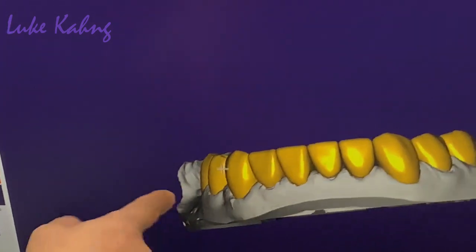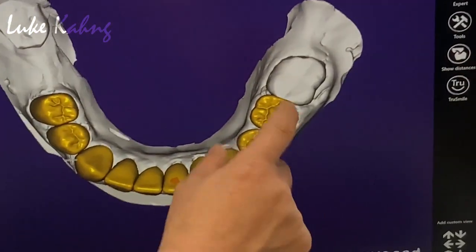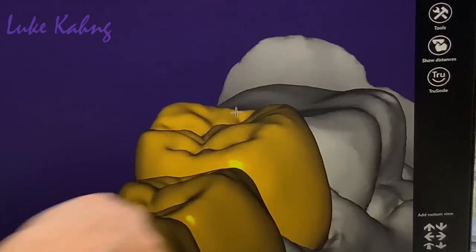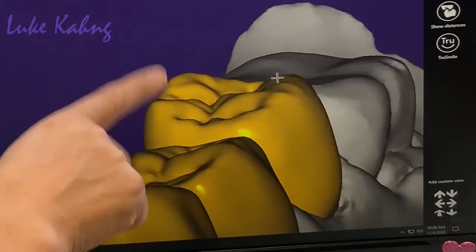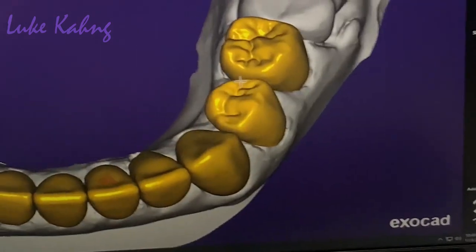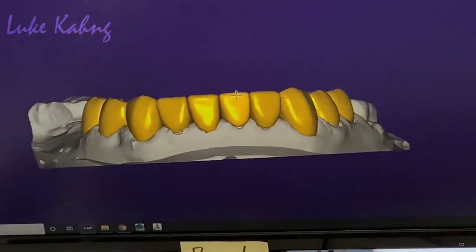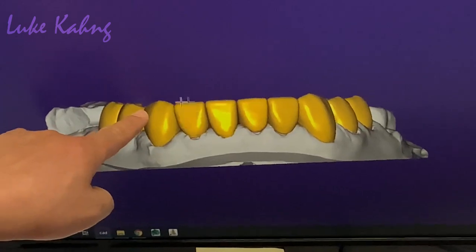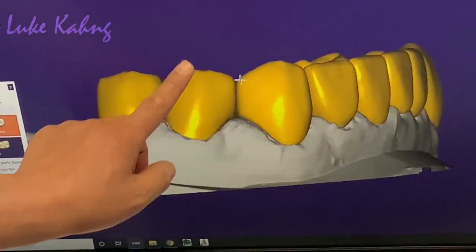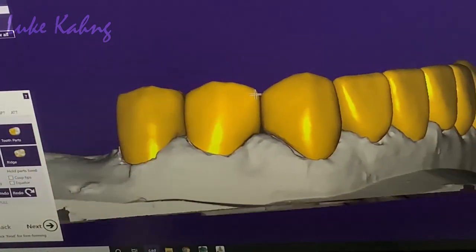Things good. Now, when you see the occlusion view, this marginal ridge is higher than the other side. So the distal area, make it lower, that's okay. Distal, yes. Yes, better. I like the occlusion anatomy, but here, maybe. Can you show me the disc? Still the margin is low. Add it. Okay, a little bit higher. Okay, this one too.